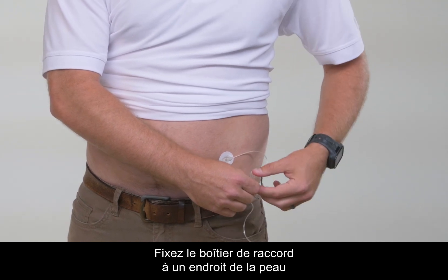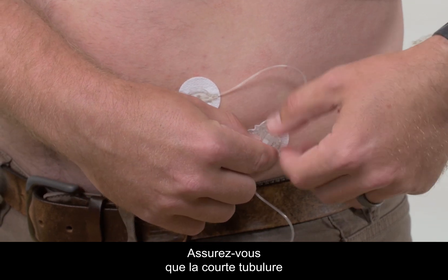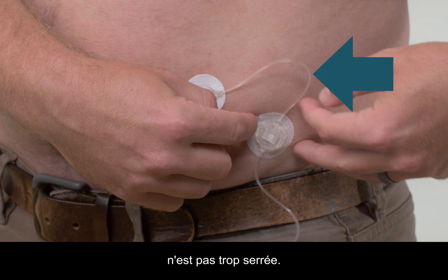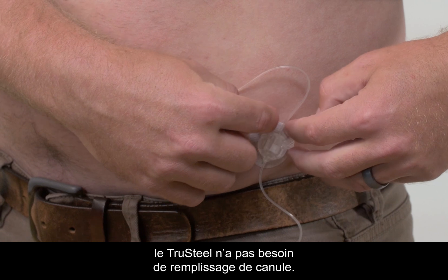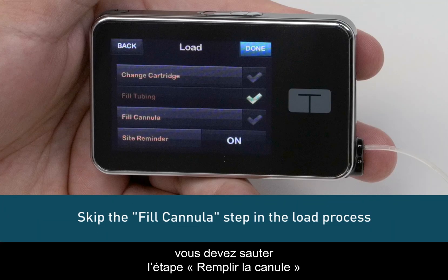Next, remove the paper backing from the coupling housing. Attach the coupling housing to a location on your skin that will allow for easy disconnection. Ensure that the short tail of tubing between the needle and coupling housing is not too tight. Because it doesn't use a separate introducer needle, the True Steel does not require a cannula fill.